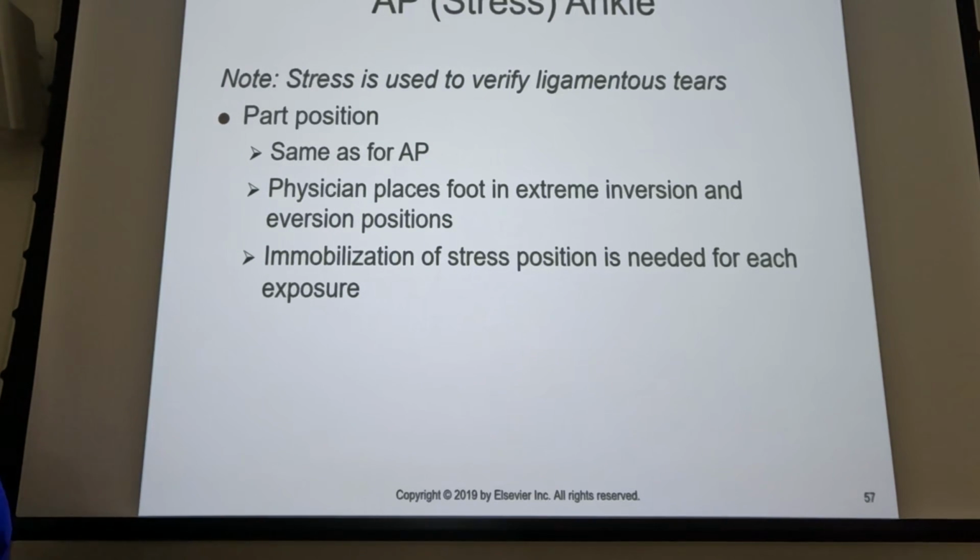If the doctor says, I need you to shoot stress views, your answer is, are you coming down to do that? So you're not providing the stress views because at that point, you're clinically manipulating an injury and your insurance doesn't cover you for that. So you can have the patient do it.